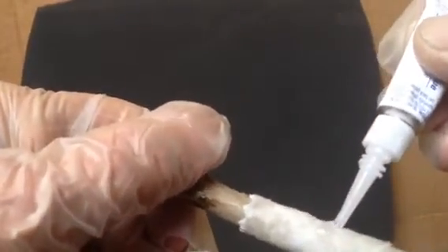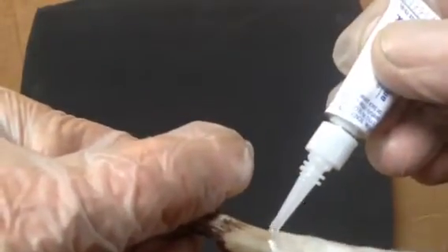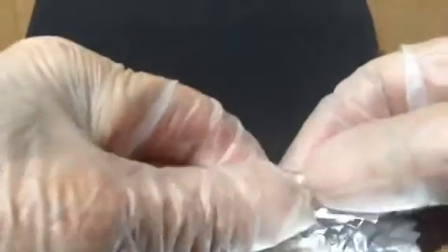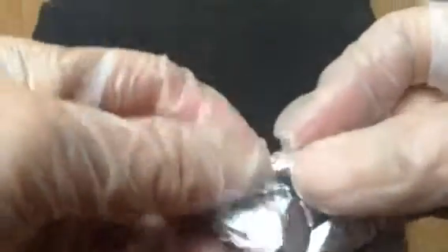And that's our final application of super glue. We just wrap that up with the aluminum foil once again, all the way around. This will cure within 10 minutes and be 90% of its eventual strength, and then within half an hour.